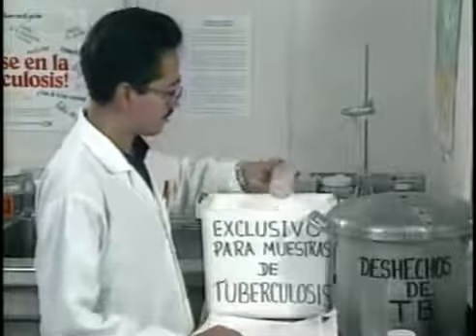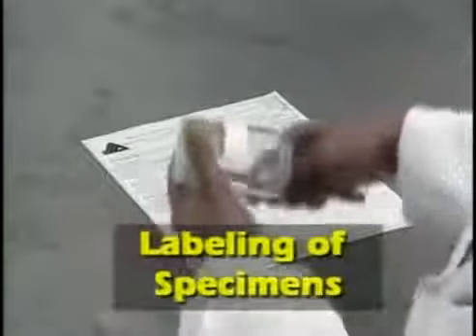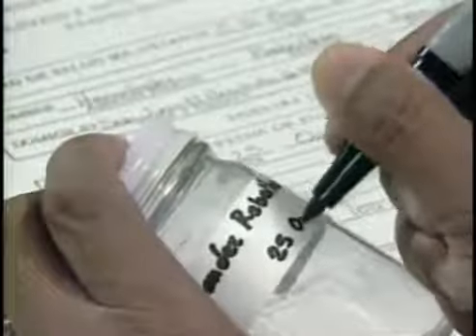It is critical to label a specimen properly to avoid confusion and delay. A request form must accompany each specimen. The information on the form must exactly match the information on the container. Always label the container on the side, never on the lid. Using an indelible marking pen, write the name of the TB suspect and the date of collection.